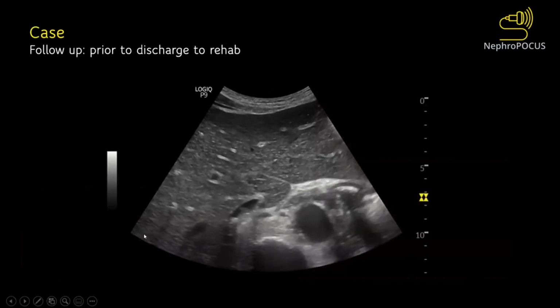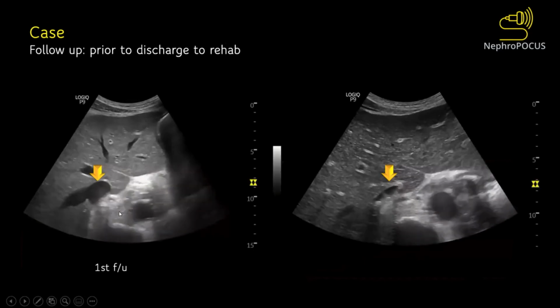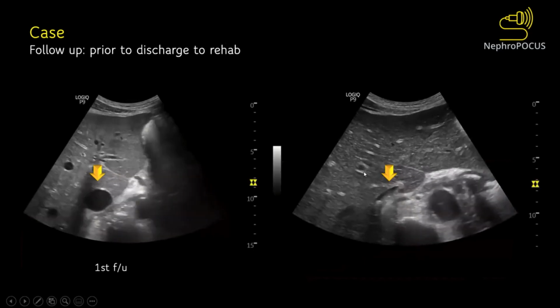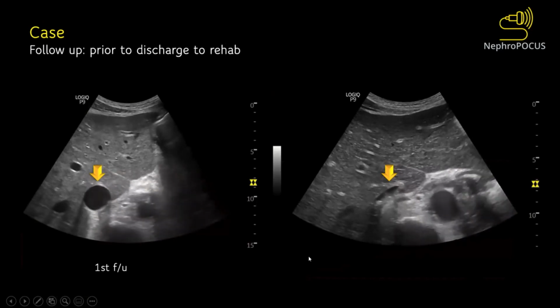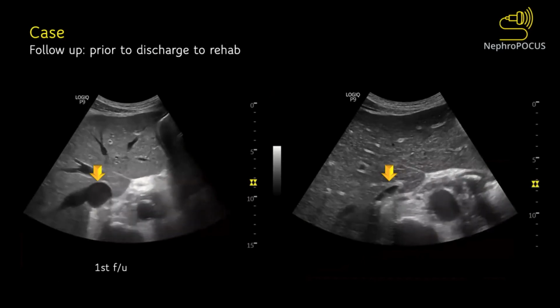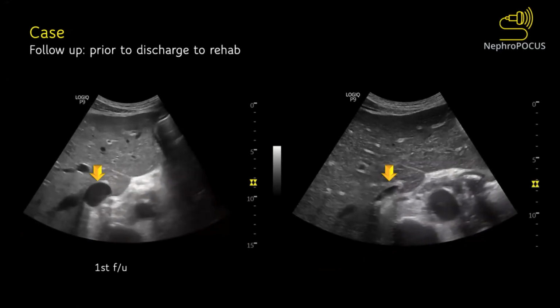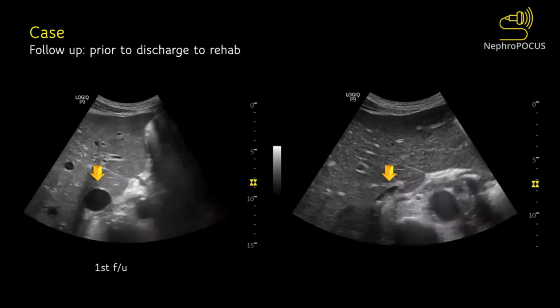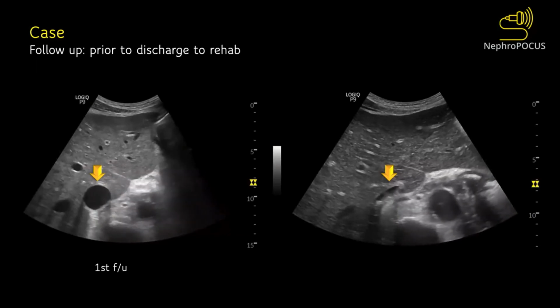It's pretty small. Initially, remember, it was so big. I'll show you the comparison. So initially it was like this. It's so big. It was actually on the first follow-up. And here is the final IVC prior to discharge to rehab. So you can follow the decongestion pattern over a period of time. And it's an additional add-on point to your IVC or whatever you use. I'm not saying this has to be used. This is not the primary thing that you have to use, but it definitely guides your therapy.